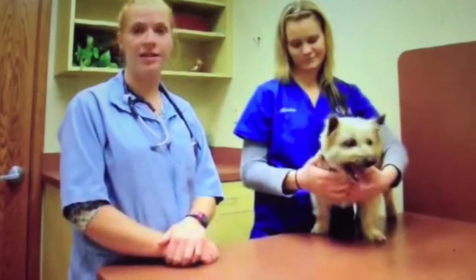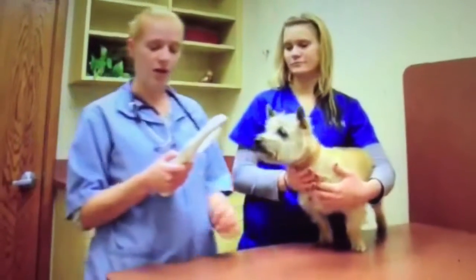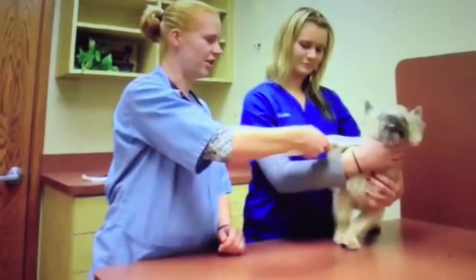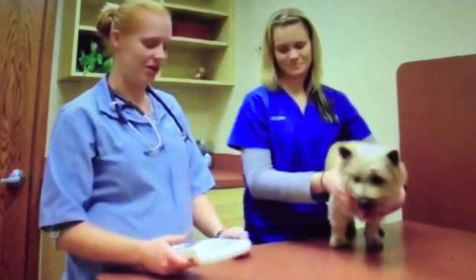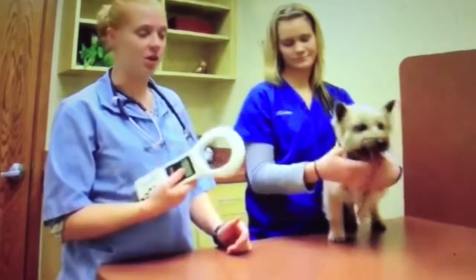First, we'd want to make sure that he doesn't already have a microchip. So you always want to check with the microchip scanner, and it just checks for any chips. He's a little startled by it. And so there's no chip on Bowser at this point. This scanner is one of many varieties of scanners that can read different chips.